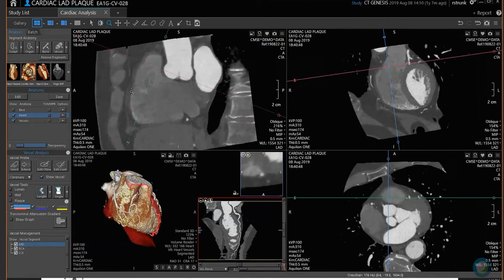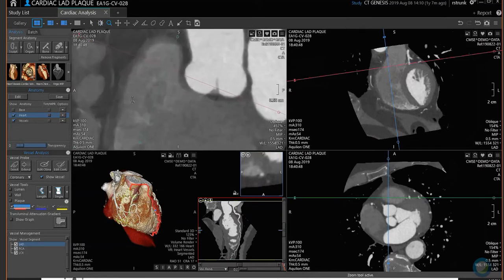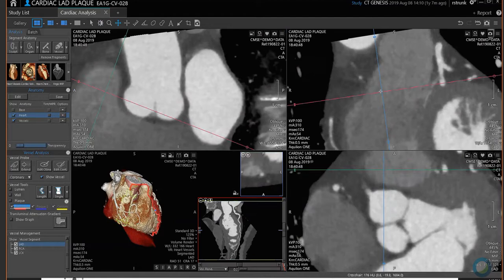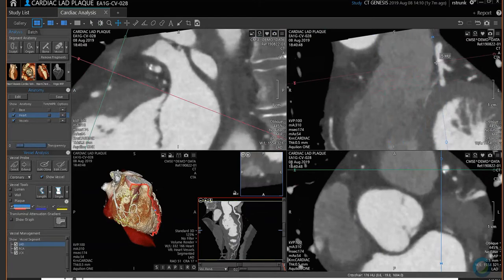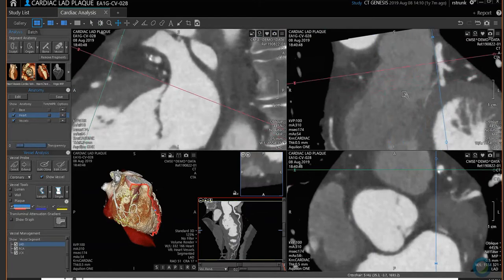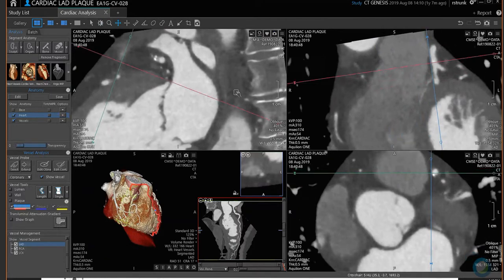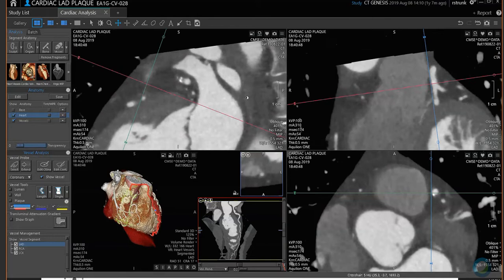The magnifying glass will actually magnify the image. And this is the pan — so if you need to recenter something. It's actually the left and middle mouse at the same time. Just holding the middle mouse will pan it, and your right and left mouse will do the windowing. The shortcuts are on the mouse, but they're always up here on the toolbar as well.